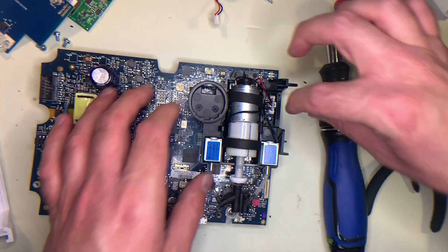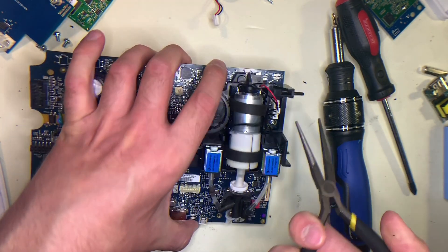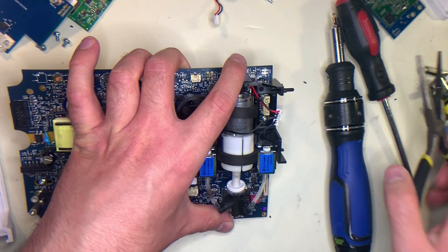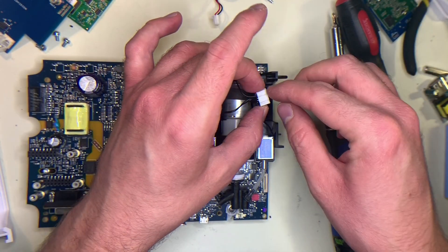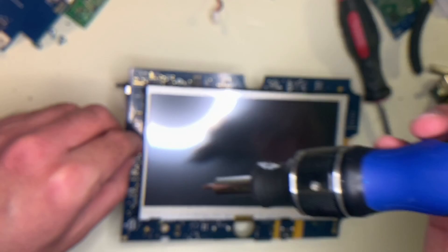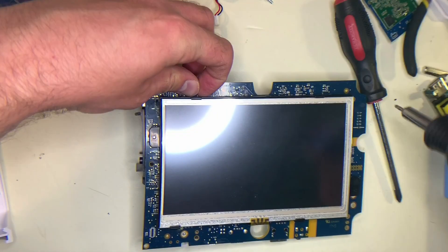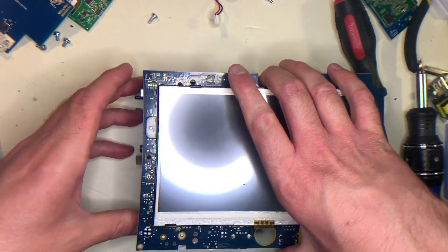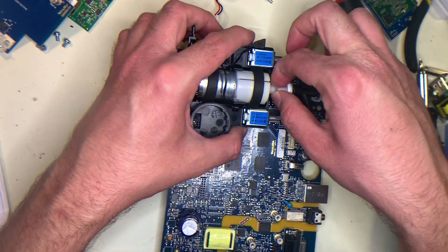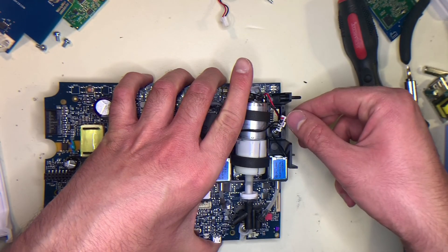Now we want to remove the pump. Go down here and remove this Molex — be careful not to pull on the wires; for that you might want to use a pair of needle nose pliers. Grab only the plastic, press down on the tab at the top, and pull it out like that. It's really important you don't pull on the cables themselves, just on the plastic. Then remove the Torx screws on this side that are holding the pump in place, being careful of the screen. The pump is now pretty loose — the only thing holding it in is the rubber components. To reassemble, just do the opposite: reattach the two Torx screws and push the Molex back into place.